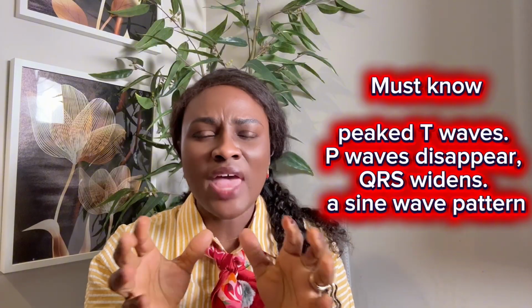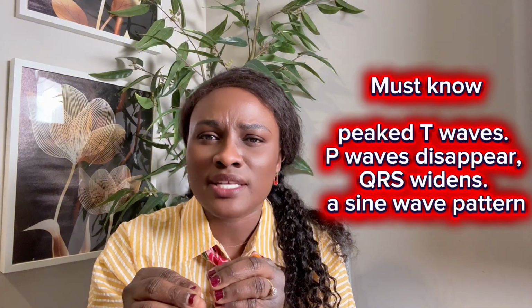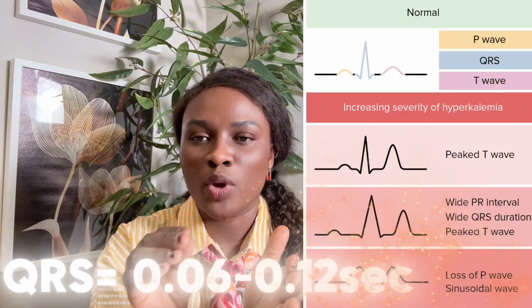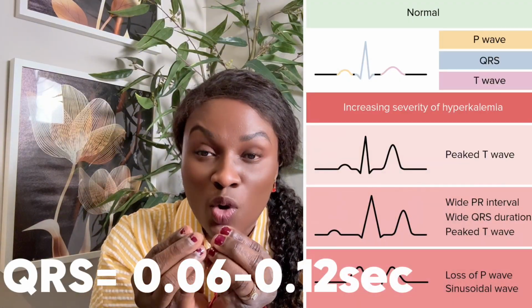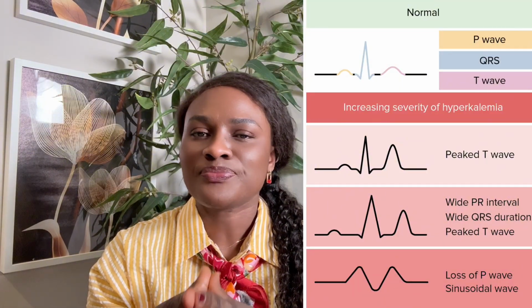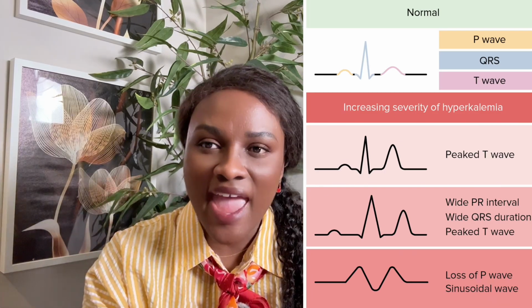First, it starts subtly. There's peaked T waves. Then the P waves disappear. Then the QRS complex widens. The QRS is usually 0.12 seconds or your small 3 boxes. Okay, but in hyperkalemia, it widens. So eventually, what happens? There's a sine wave pattern happening. Then, guess what? Code is waiting to happen, right?